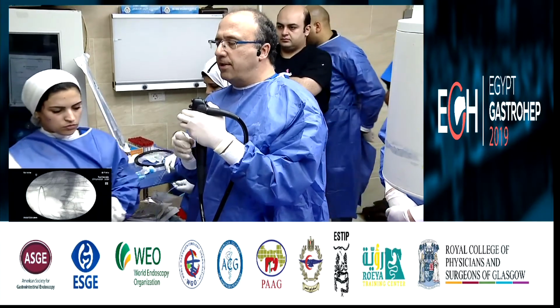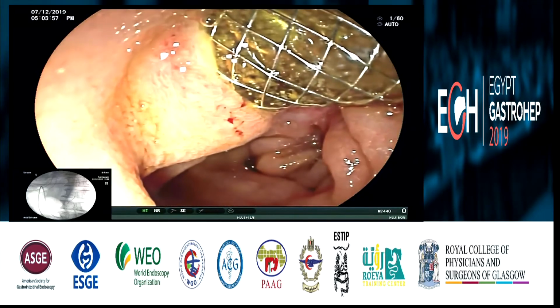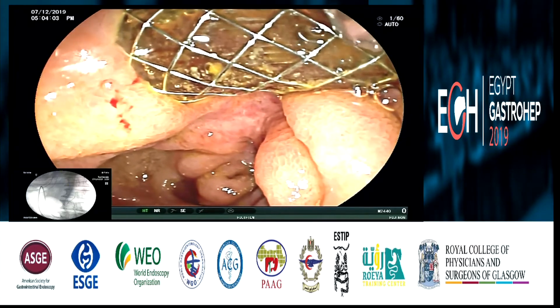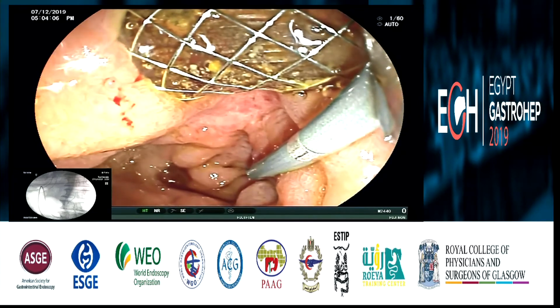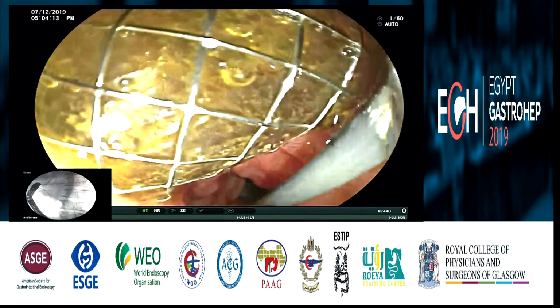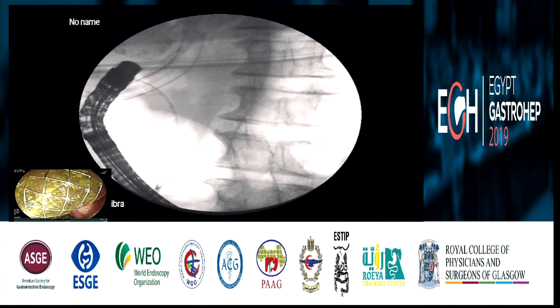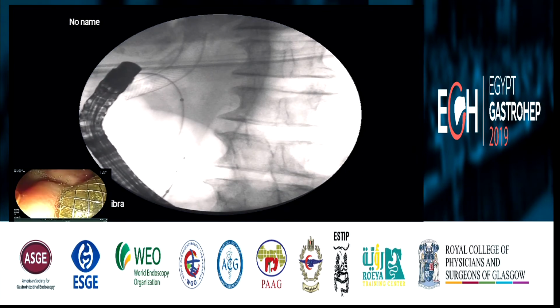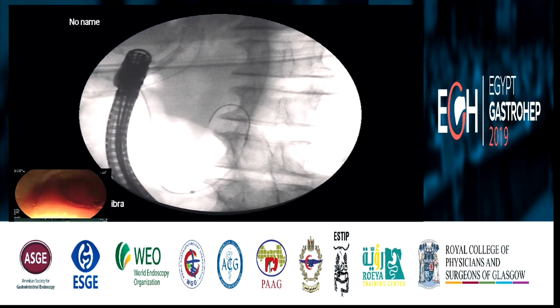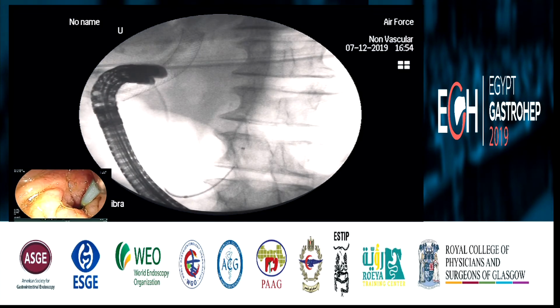And through the scopic picture, duodenal, please. So what you are seeing now is the duodenostomy stent, the duodenal lumen. We have to make the guide wire go past this stricture. Okay? We have fluoro. Yeah, make it go. Make it go. Can you make the guide wire go through, please? You push? Yeah. You have resistance. Okay? Yes, I'm pushing my side viewer a little bit deeper. You're deep. You almost reach the Treitz. Put the wire in, please, Salma.